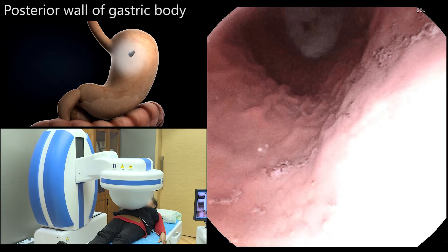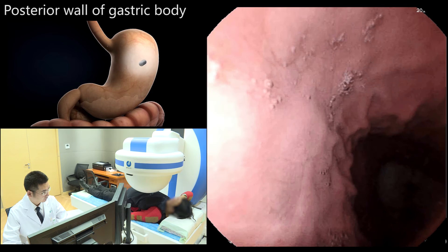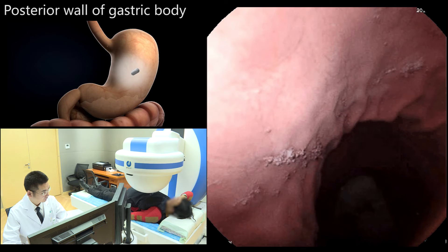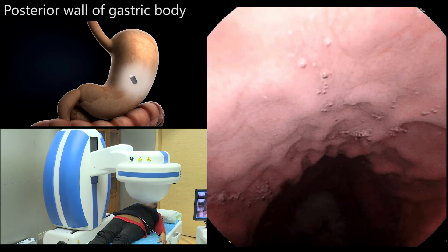With the patient in the supine position, the magnetic ball was moved to the patient's upper left abdomen and lowered, with the camera oriented vertically downwards to observe the posterior wall of the gastric body.